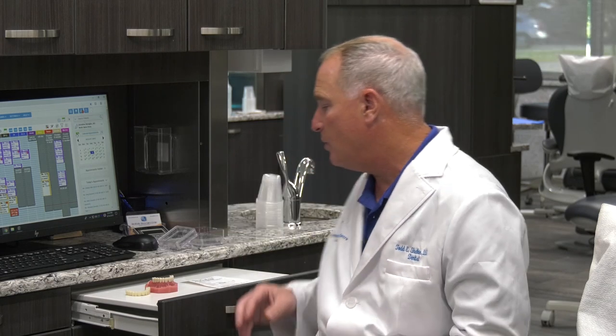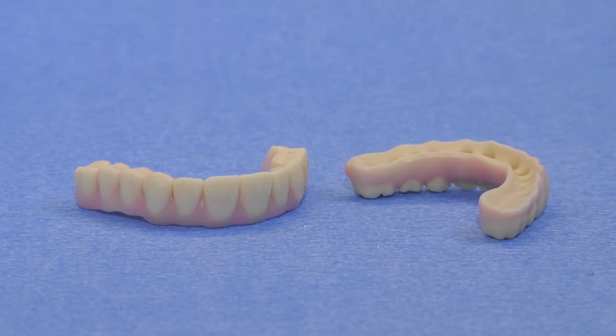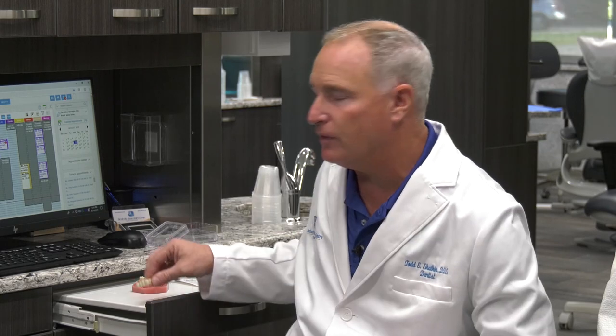Make sure you mark the midline and mark the smile line. You can use toothpicks to mark the horizontal and vertical and put those in the wax. Once you've got that all marked, send it back to us and we will mount the case and do a try-in. The try-in is very important. We will send you back a milled acrylic try-in to try in the patient's mouth — let the patient take a look, see if they're happy with how it looks. Make sure the midline is good, the occlusion is good, and the general smile line is good.